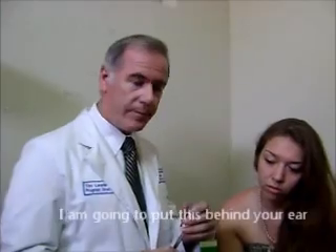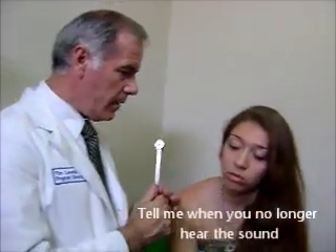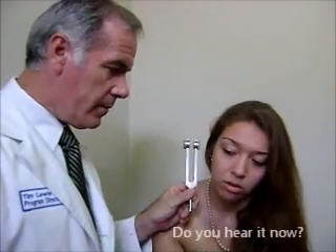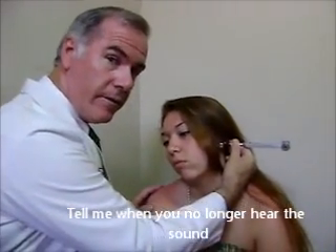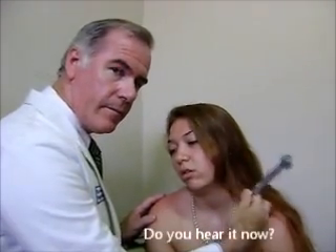Let's try it. Erica, I'm going to put this behind your ear. Tell me when you no longer hear the sound. Okay. Do you hear it now? Yes. And you do it on the other side. When you no longer hear the sound — do you hear it now? Yes.